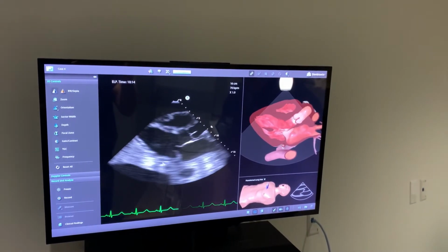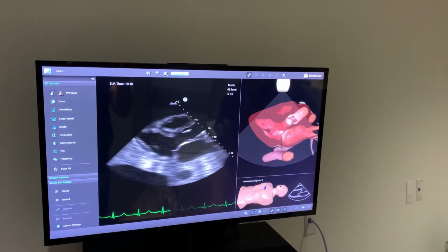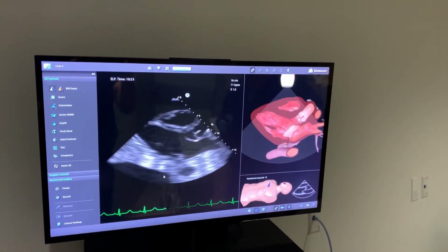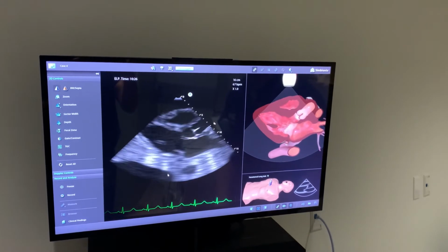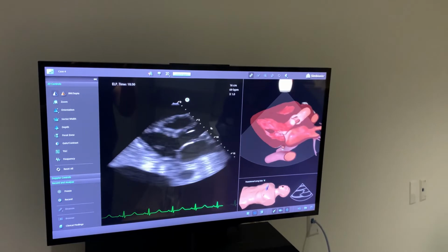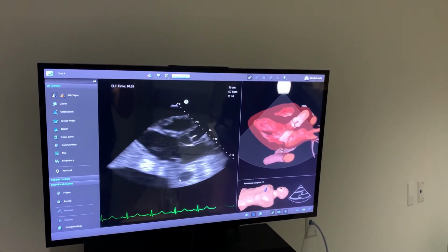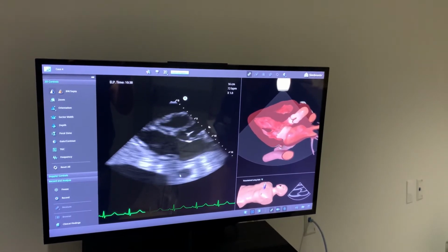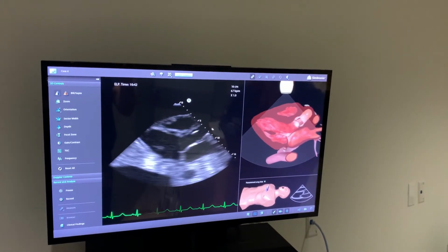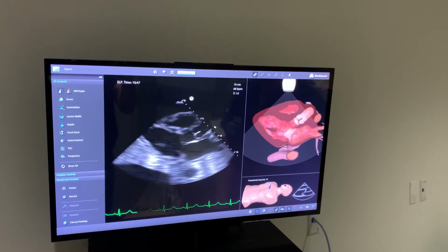This patient, in this view at least, doesn't have a pericardial effusion, which we would see as fluid collecting posteriorly. It would collect between the heart and the descending aorta. And fluid is black. A pleural effusion, you could also see sometimes in these views, that also collects posterior to the heart, but it would be posterior to the aorta here, as opposed to a pericardial effusion, which is between the heart and the aorta. So that's why Mark earlier had changed the depth to be able to see the aorta, which can help with the pericardial effusion versus pleural effusion question. Exactly.